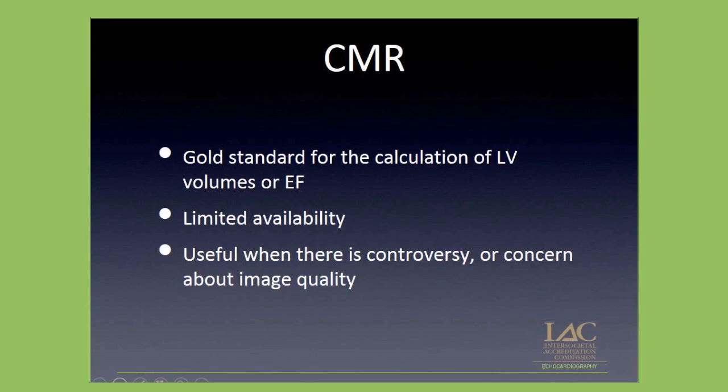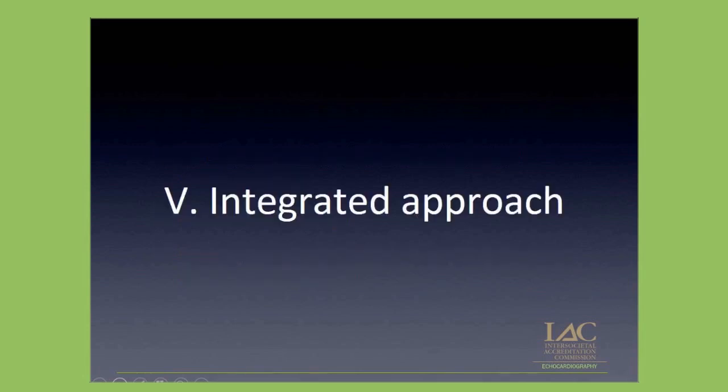If you have imaged these patients, you remember patients that have had mastectomies, patients with breast expanders, patients with brand new breast implants. All of these patients are very challenging to image, so it is very important to remember that this can be an alternative. And also in situations where, out of the severity of the decision that you're about to make, i.e. suggesting stopping therapy, you want to be 100% sure that you are telling the oncologist the truth.